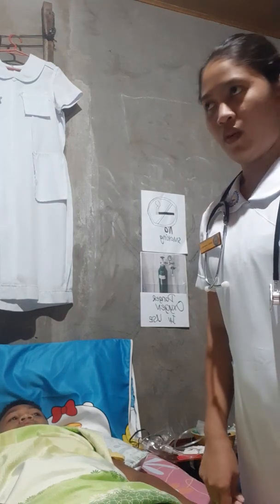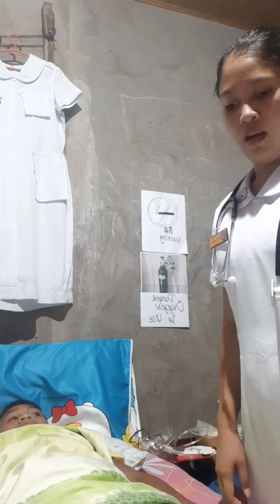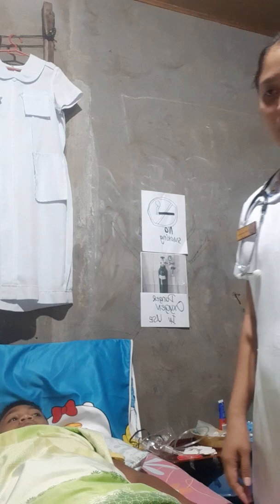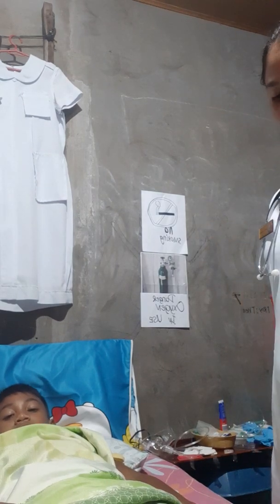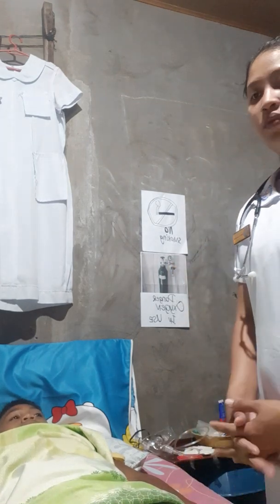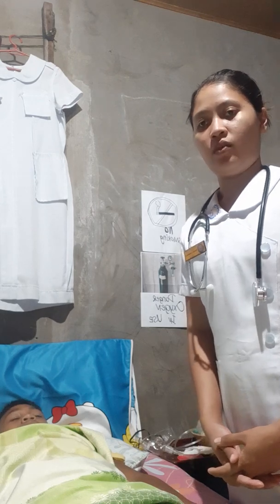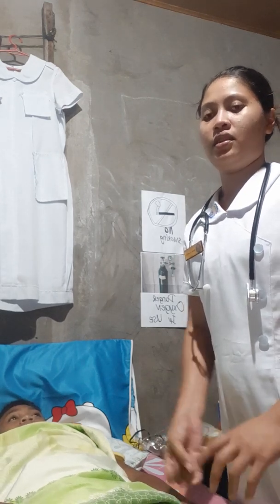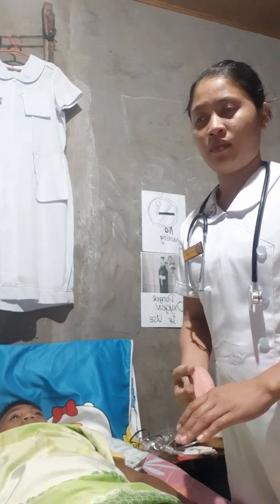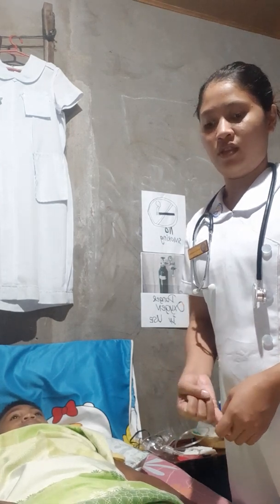Then for the equipment: oxygen supply with flow meter, humidifier with distilled water or tap water according to hospital policy or protocol, and gauze pad and gloves. Then for the assessment, observe the client for any signs and symptoms associated with hypoxia such as cyanosis, breathing pattern, lung sounds, chest movements, apprehension, and decreased level of consciousness.